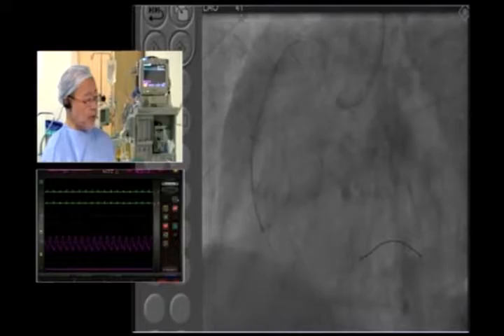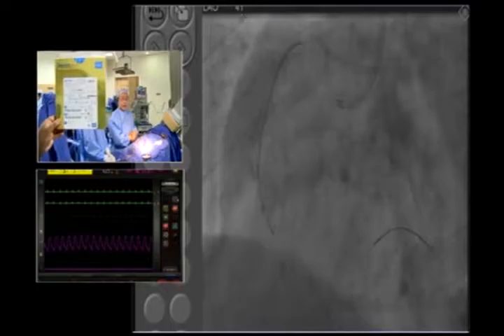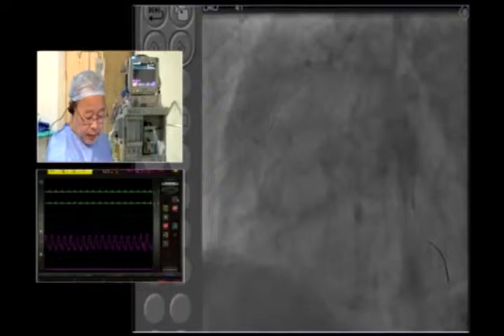This was a 60 millimeter stent. The stent deployment was so difficult. So I was taking some kind of a technique, you know, to increase the backup support, and then the stent gradually passed through. Very nice. So this is the BioMime. Okay, next view. The position is fine.